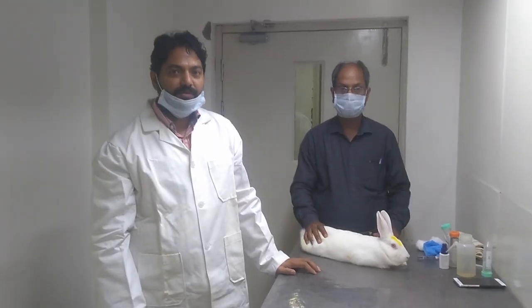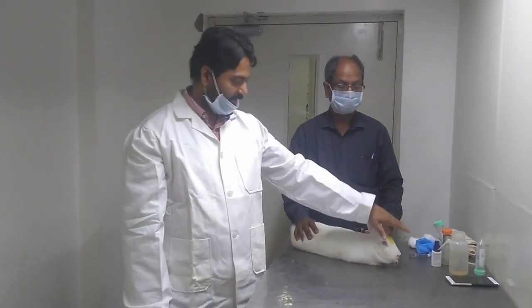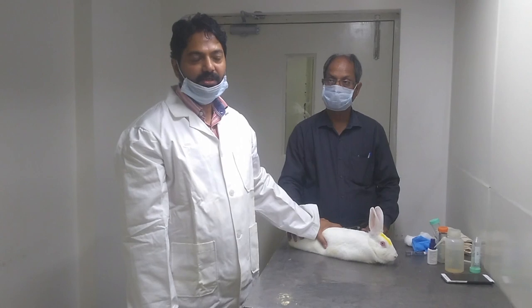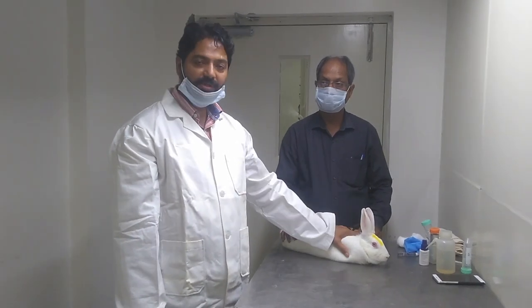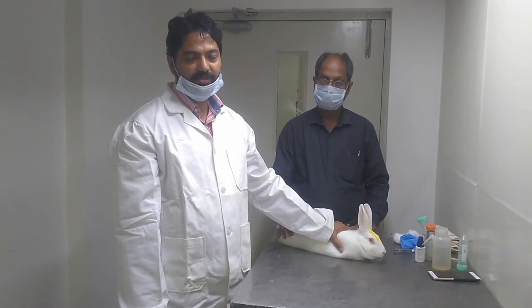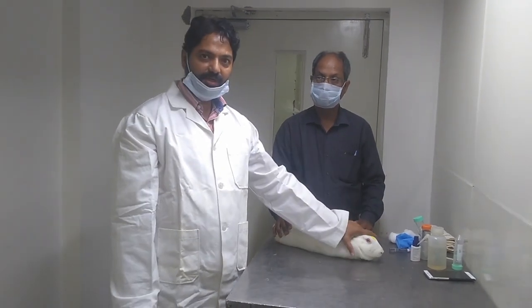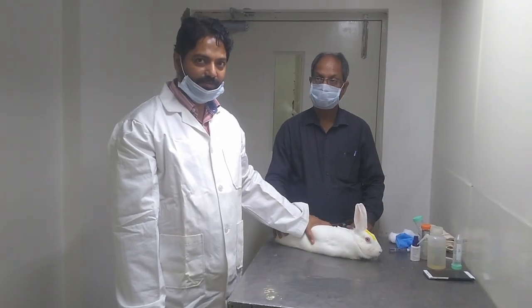Now we have prepared the emulsion, and we have come to the animal house. This is our rabbit, which will be immunized. Before immunization, we have to take a pre-immune bleed, so that we can compare the serum and the anti-serum better. So we will now see how we immunize it.